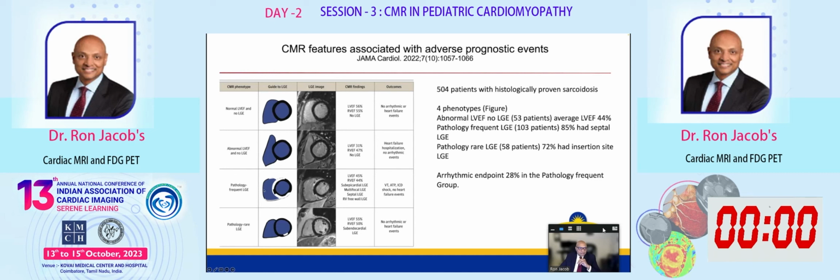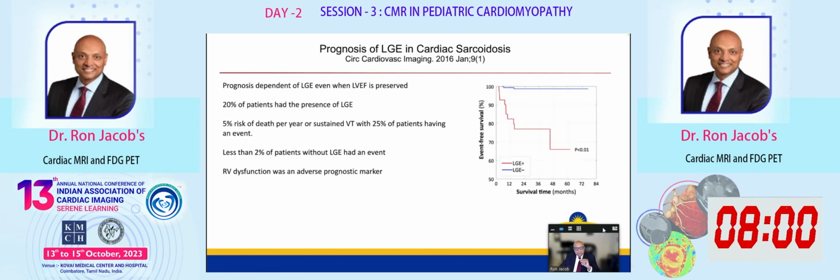Whereas if you have pathology frequent, a lot of LGE, you had VT and ICD shocks, and in patients with no LGE and abnormal EF, they had heart failure but no arrhythmic events. So that's just a broad brushstroke of how you can leverage the LGE and the findings on CMR to have a conversation with the patient.